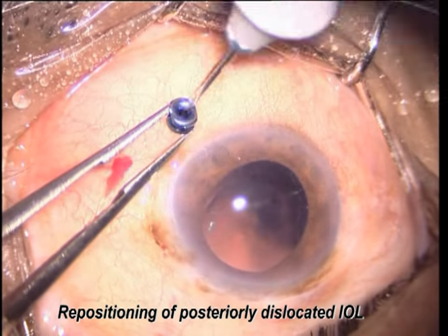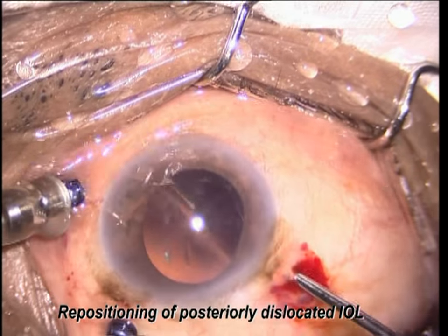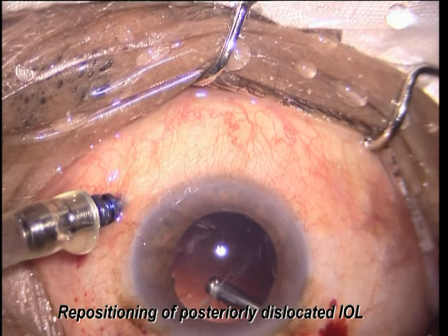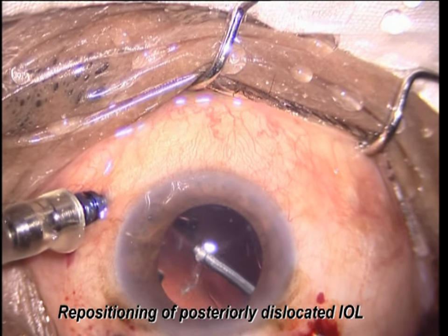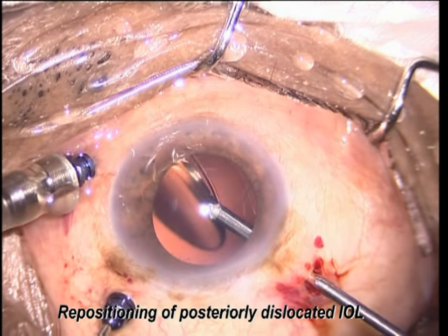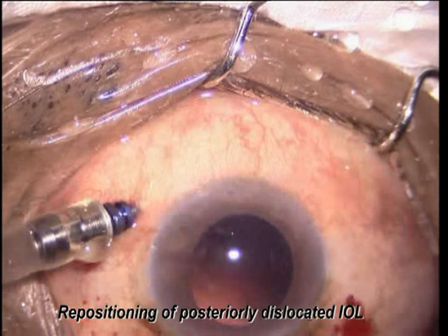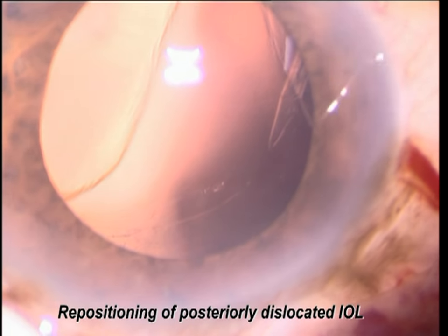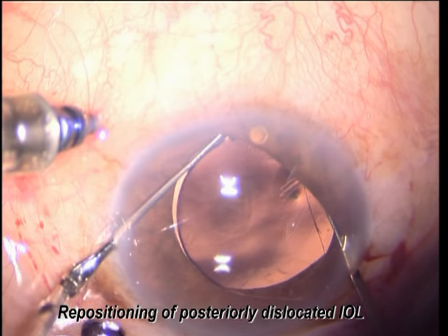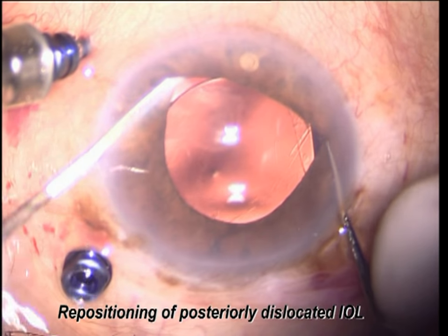Sometimes a lens gets posteriorly dislocated either into the posterior vitreous or over the retina — they need 3-port vitrectomy. Do 3-port vitrectomy to cut all traction bands. If the lens is floating, you can just hold it with forceps and bring it back into the anterior chamber. If there is no capsular support, remove the lens and go for another option like glued IOL, scleral fixation, or iris claw. In this case there was clear visibility of the anterior capsule, so the lens is implanted in the sulcus with a minimum incision.